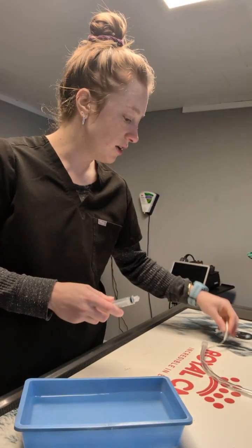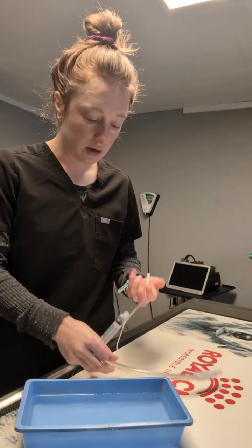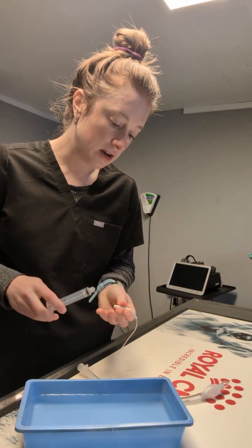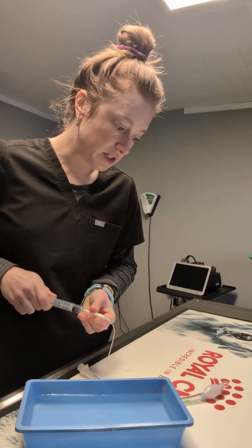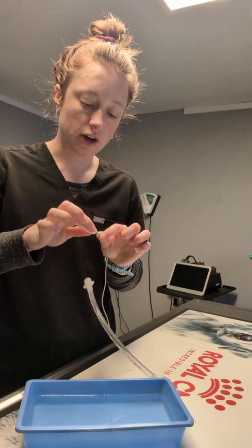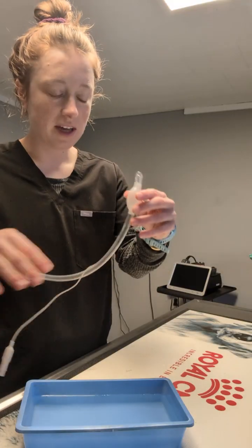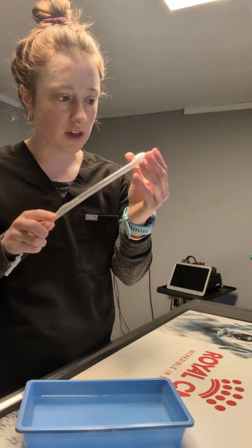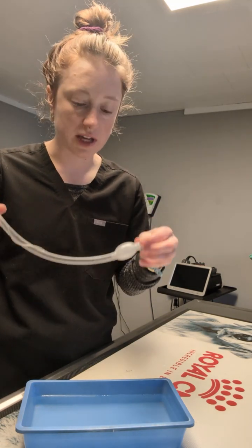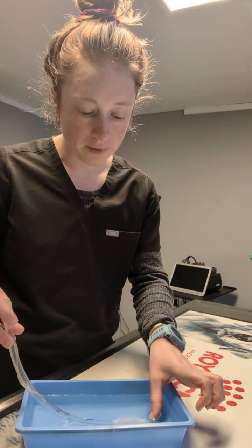Perform a leak test on an endotracheal tube. They always start uninflated. So I just want to use my syringe, add some air in, and this is a good way to also check when the cuff is totally inflated. The indicator is like a soft grape, is what my preceptor tells me. And then I just want to look at the cuff and make sure that it is inflating evenly and properly. Then to check the inflation, make sure it's not losing air, I can either watch it over time, make sure it's not getting smaller, or I can submerge it in water.